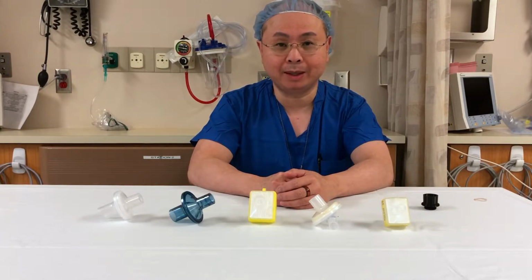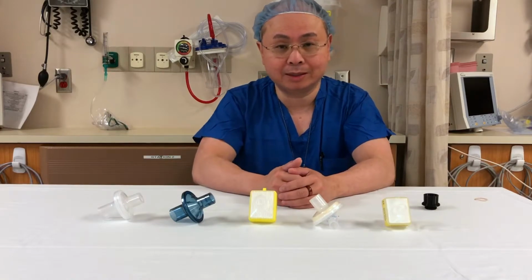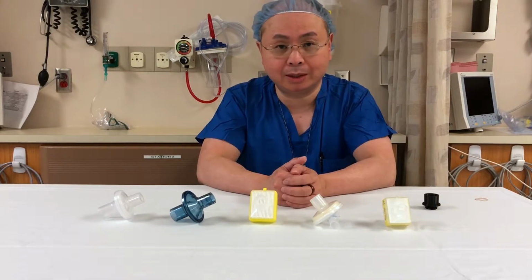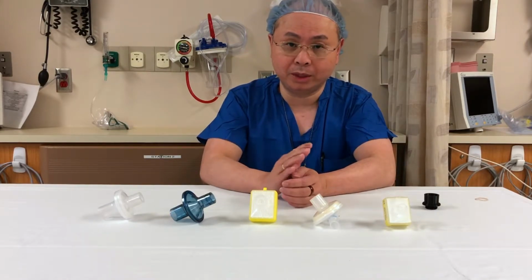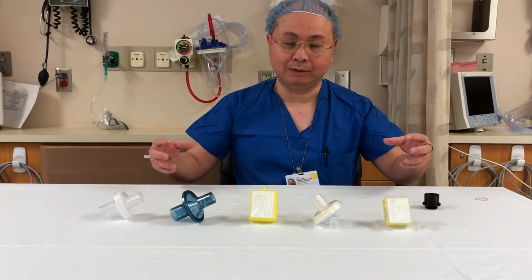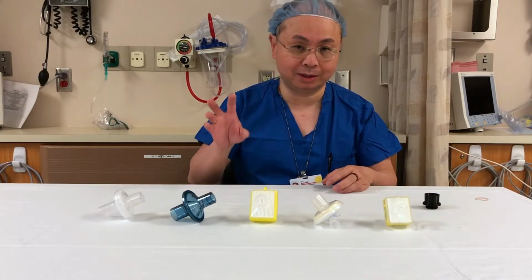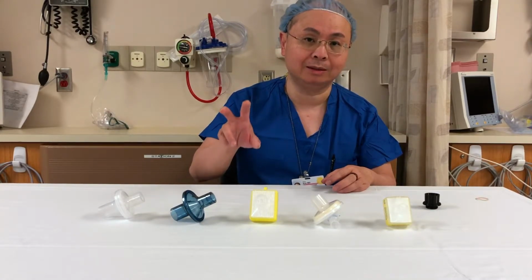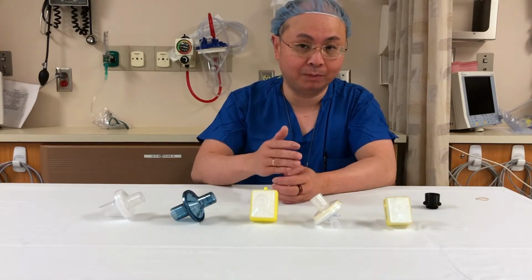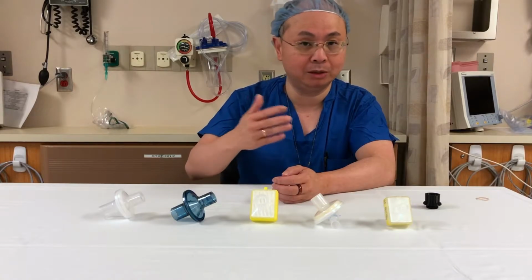I'm here to tell you about anesthesia circuit filters. Here we have 5 different anesthesia circuit filters. These are the kind of things that are used to protect patients on anesthesia ventilators from both each other and from the ventilator. Because the circuit on a ventilator is replaced, but the internals of the ventilator are not replaced between patients. So we need filters to protect both the machine from the patient and also from cross-contamination from patient to patient.